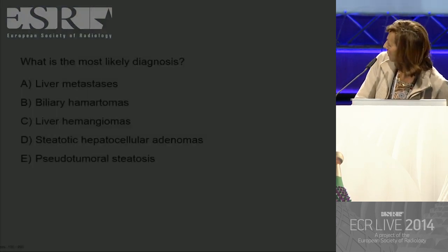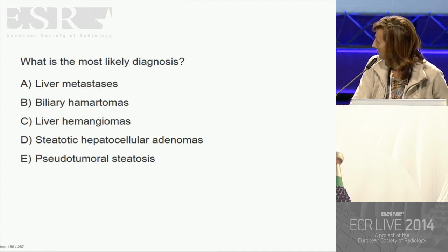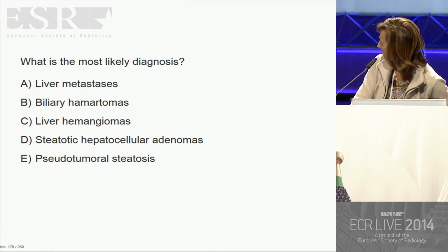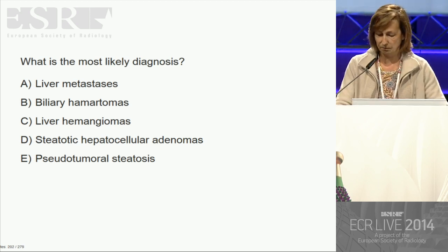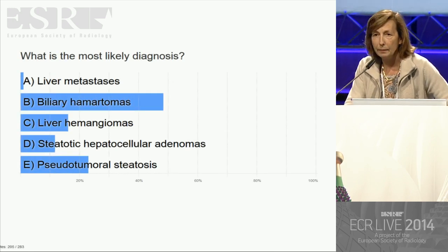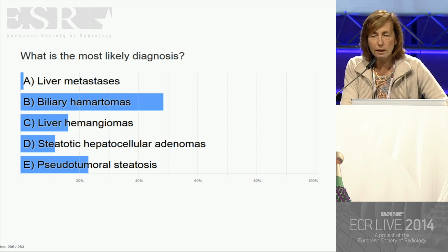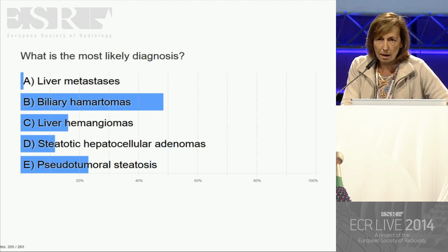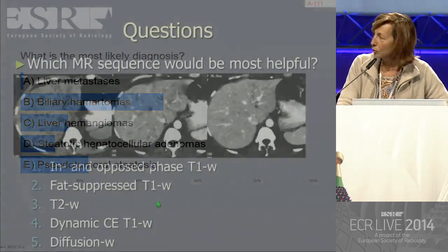Can we see the vote, please? Okay, let's see the result. So again, many different answers. Indeed, I agree that only the CT makes things very difficult, because there is probably one exam you would like to see. And I'm not ready to give you the answer to this question.